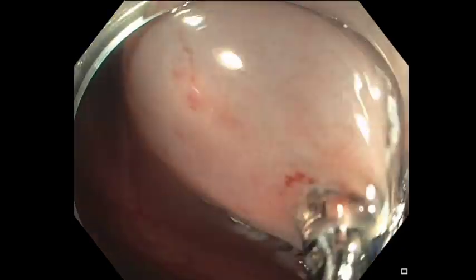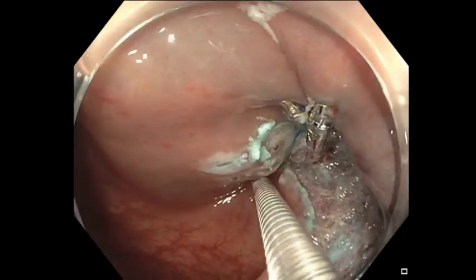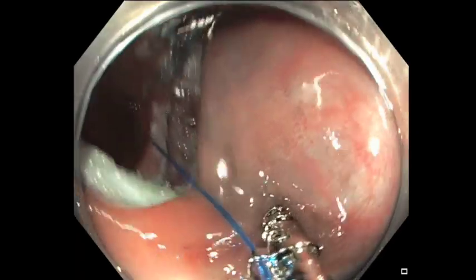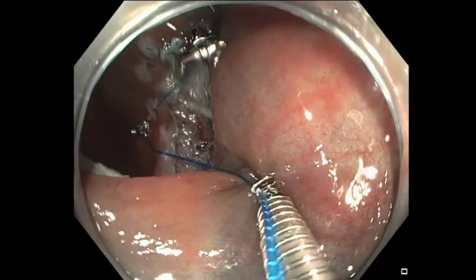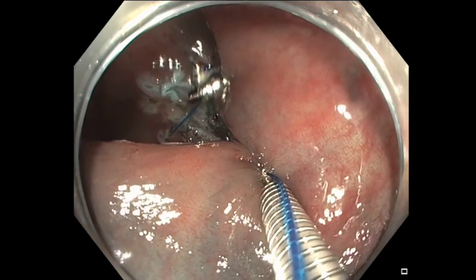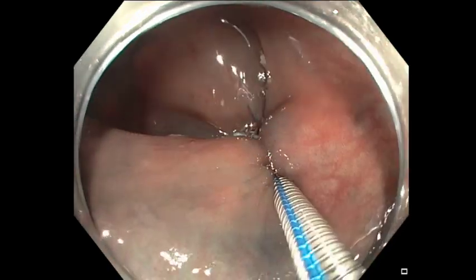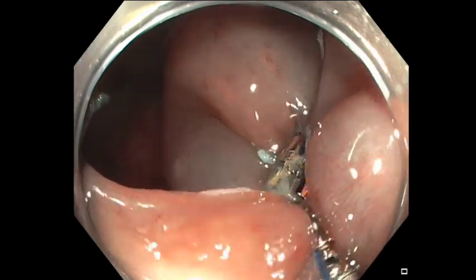So I'm using here the TAC system for closure. It's for 4 TACs. And I'm showing here how you place them. So basically, you don't want to be greedy and try to close all the lesions with 4 TACs. It's not going to work. It will form a tent. So they have to be close to each other, but not so close that they become inefficient.